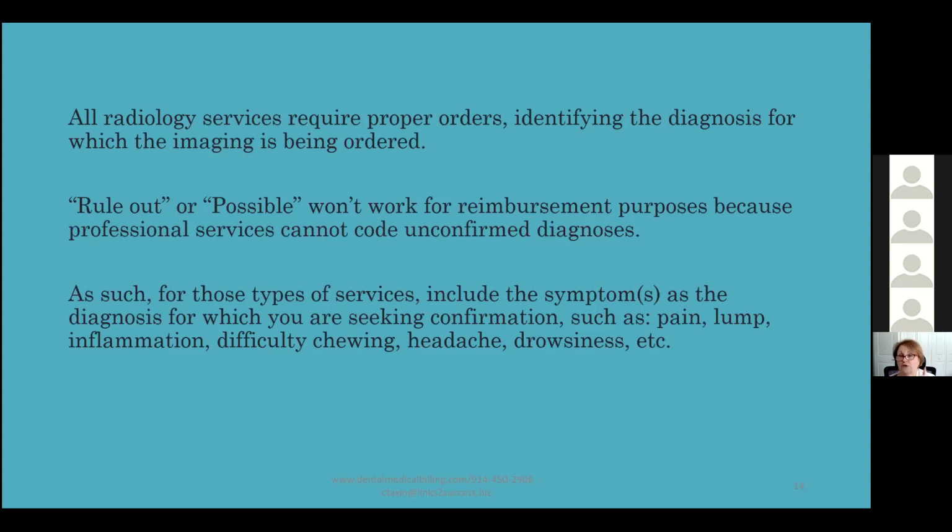However, when you're going to take the CBCT film, then that will include signs and symptoms of a diagnosis, because the reason we're taking it is to come to a specific point of treatment and diagnostic reasons why this service is so important.